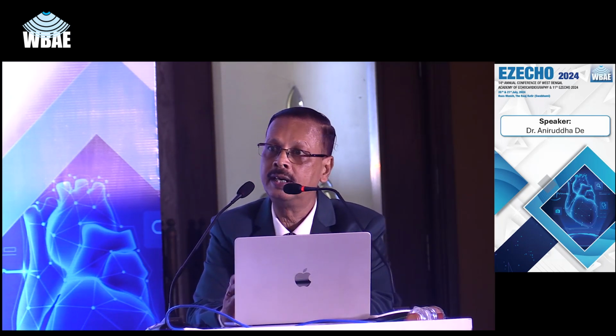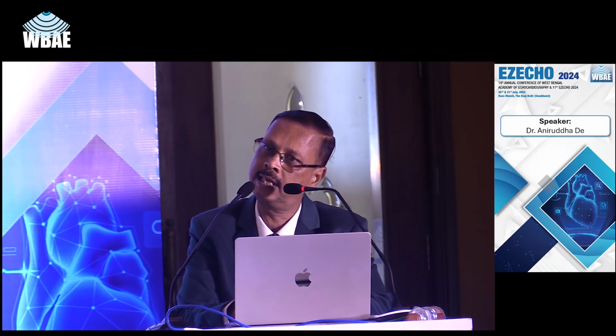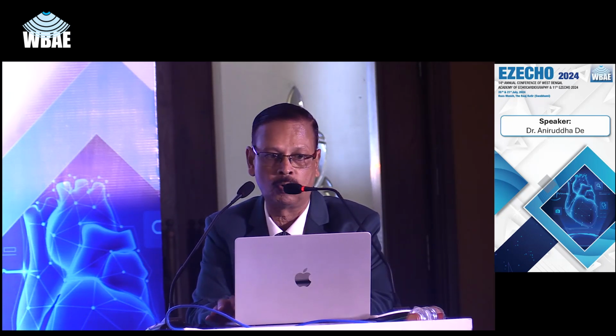And next is the IVRT. This is another important parameter you can take. For IVRT, same thing, you can average it or take the similar 10 to 20% interval. Here we can measure it, in this case about 55, which is below that, or 50.